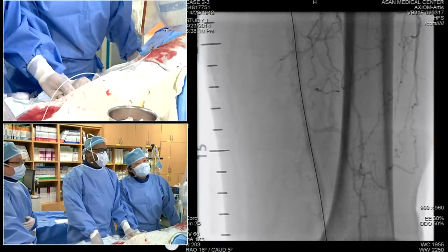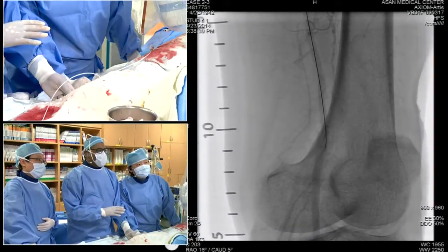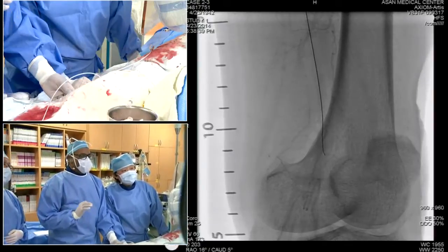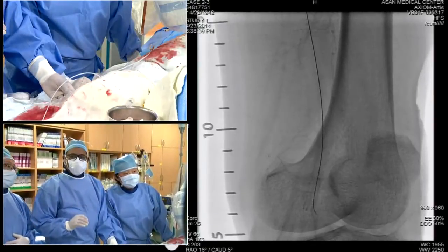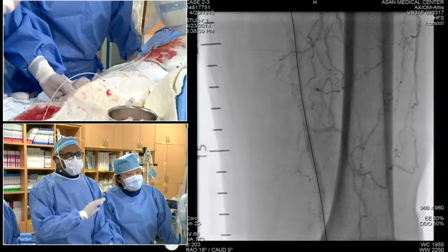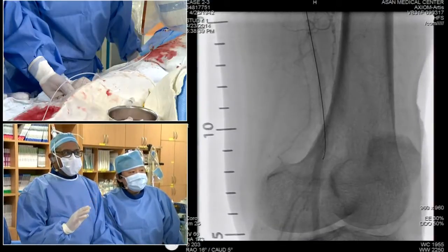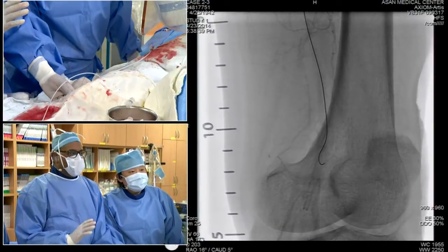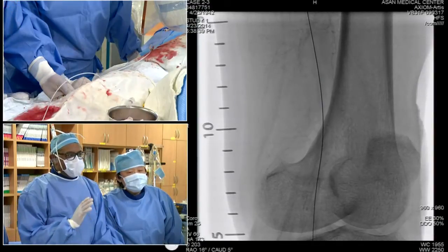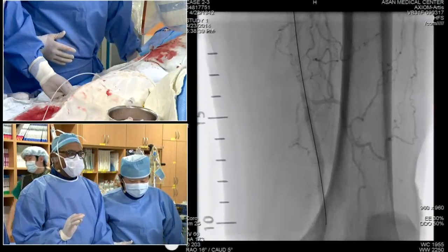Unfortunately, we started with, first of all, congratulations to an expert technique in patience and persistence. I was actually advocating for, as John was, an Outback, in which case we probably would have dilated the stent so we wouldn't have any problems over the 14 wire getting into the subintimal space. But I understand the expense associated with the Outback. So a lot of patience and technique, getting it back into the true lumen.